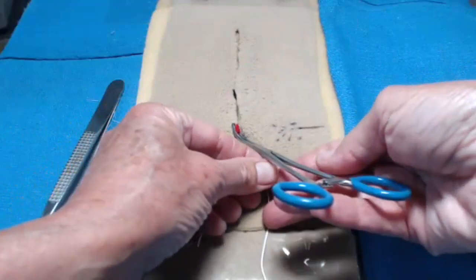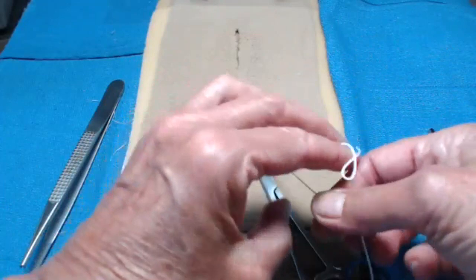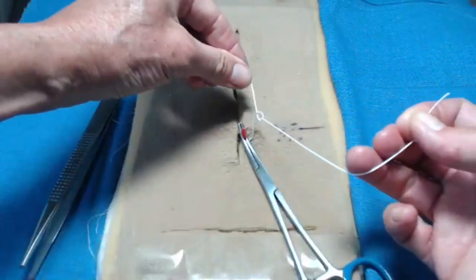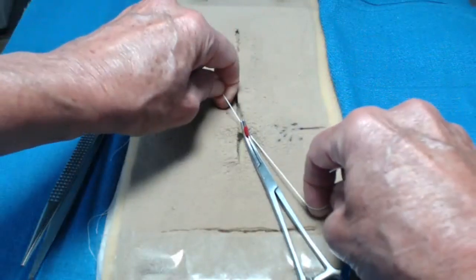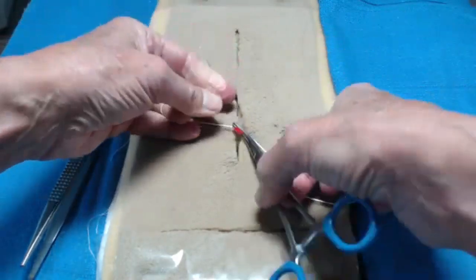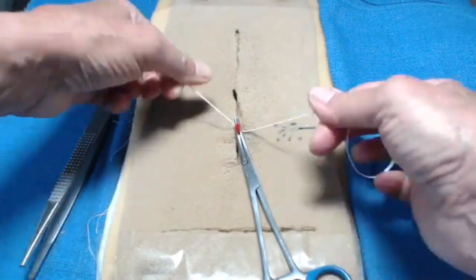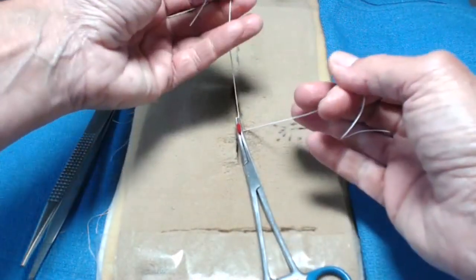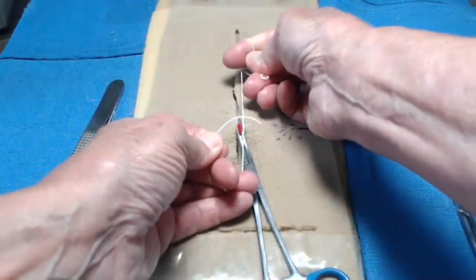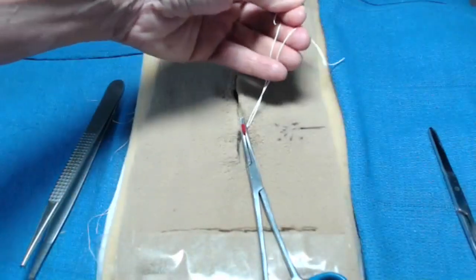That will allow us to take our piece of suture, put it under the clamp around the tip, and this is where the one-handed tie comes in very handy. We want to tie very gently. If we pull too tight and we lift, we will tear the vessel and then it will retract and it'll be harder to find and tie off.